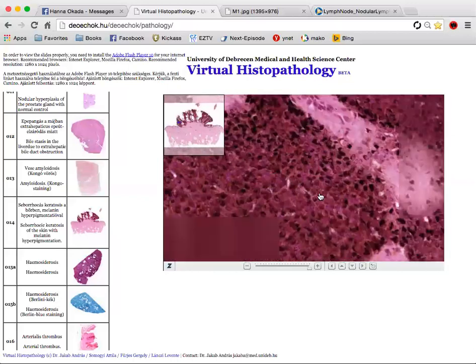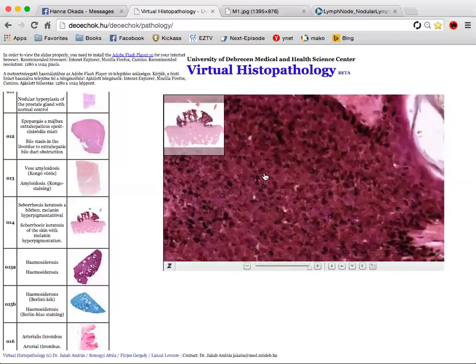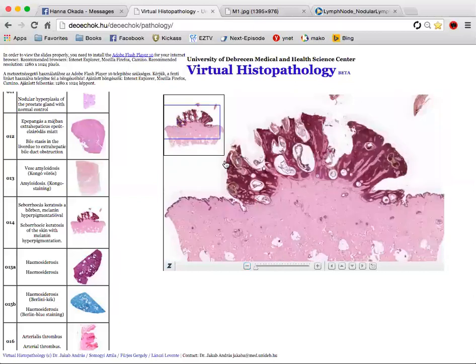And that's pretty much all. I mean, this is again completely benign, so this would not turn malignant. So again, what you have to say about this is an exophytic growth. It grows toward the outside.